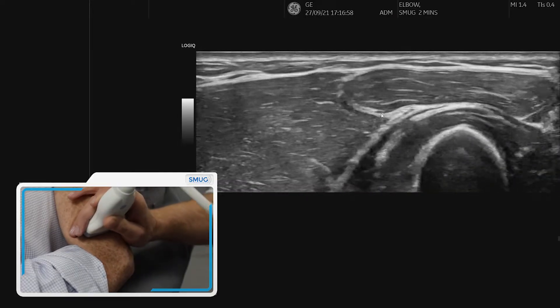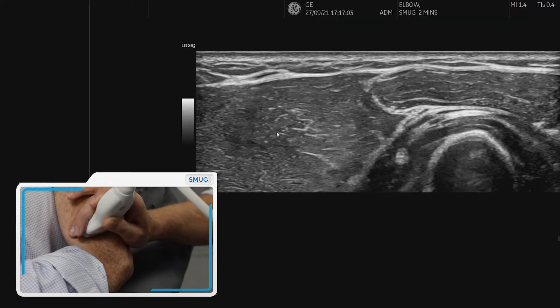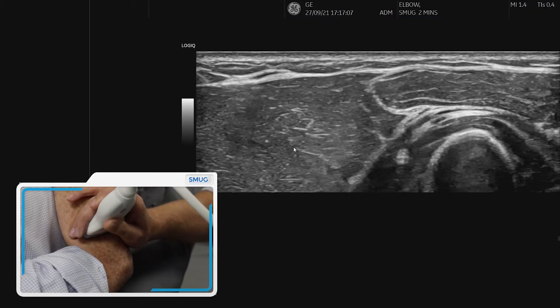Now if we move slightly superiorly, this is the muscle belly of ECRB, which is continuous with the muscle belly of ECRL — which remember doesn't attach onto the lateral epicondyle.